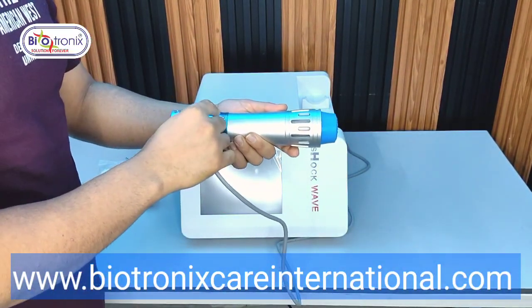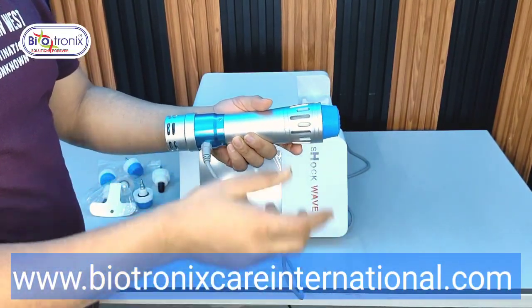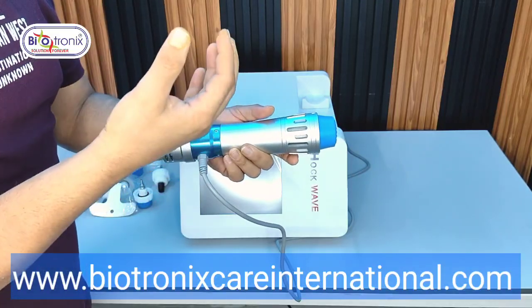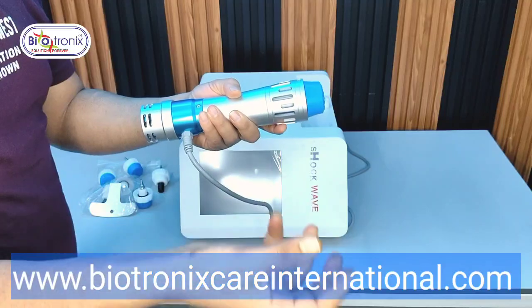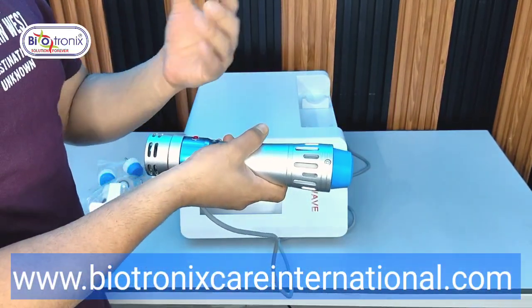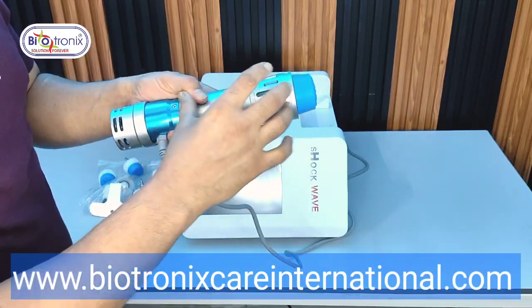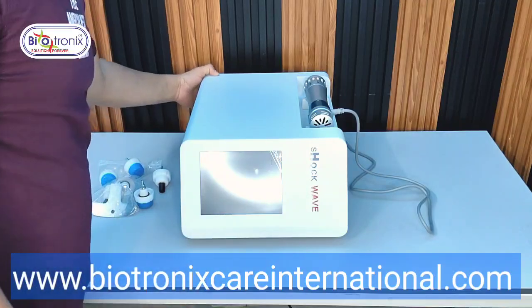And if the travel of that bullet is because of an electromagnetic field around the bullet, that means the device is electromagnetic shock wave therapy. And if the bullet travels because of some air compression or compression field, because of the pressure from that field, that means it's pneumatic. So this is the electromagnetic, where the electromagnetic field is there in the device and the bullet travels because of this.